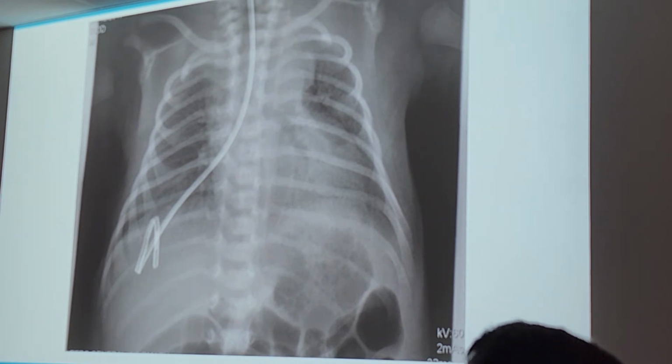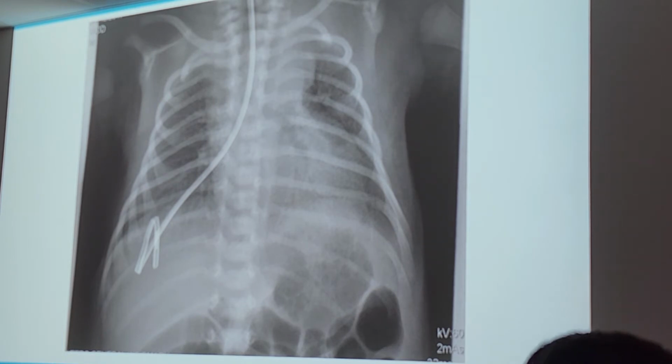Would it be reasonable to assume that patient had some sort of issue with their right lung? What if they perforated his lung by accident, and they're trying to figure out what's going on, or if he already had an issue? Could that cause pneumoperitoneum? Wait, what is your question? Could the tube have caused that, for them to be obstructed? Is that an obstruction, or is that air in the bowel? Looks like it's air and feces.